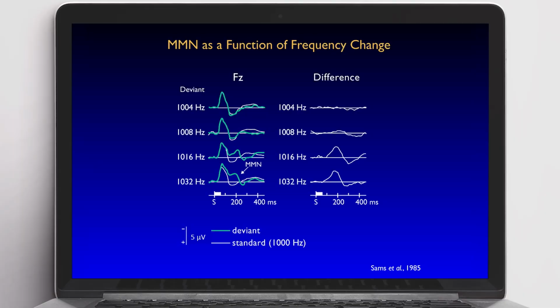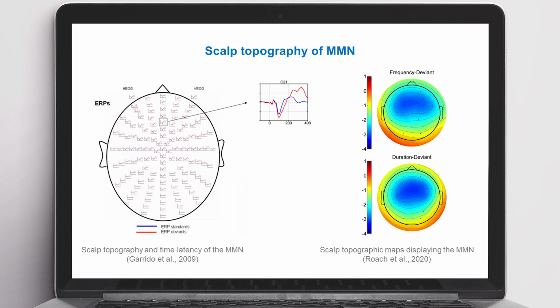The smaller the discrepancy between the deviant and standard stimuli is, the more similar the sensory responses will be, and as a result of subtraction we will see nearly a baseline. As the pitch differences between the deviant and standard stimuli increase, the mismatch negativity is detected in the subtraction result. This is a negative wave that develops between 100 and 250 milliseconds after stimulus appearance. The shift of potential can be up to 5 microvolts and is most pronounced in the frontal central leads.